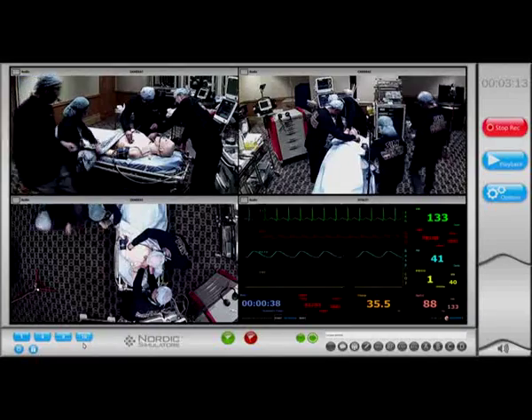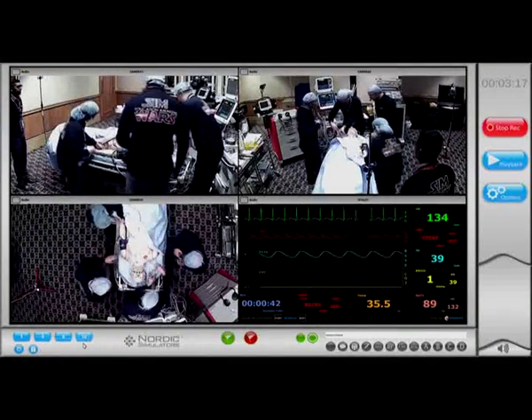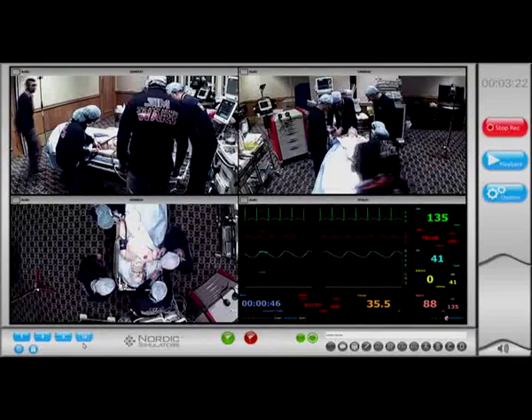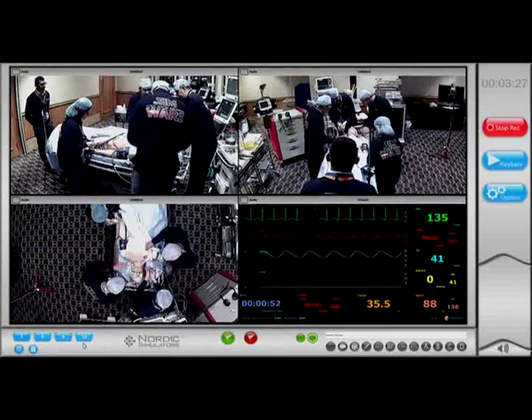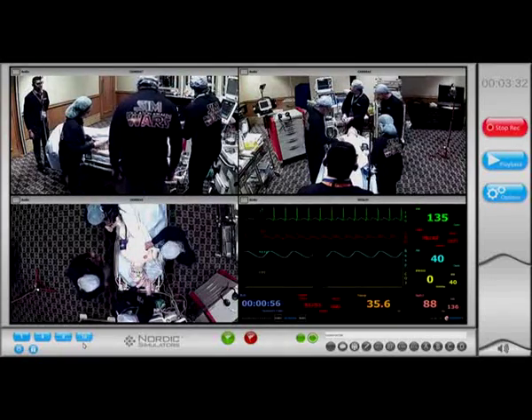Take a deep breath. Okay, I got a 22-year-old person involved in a road traffic accident. He's conscious, but he sounds disoriented. I'm just doing a respiratory examination. We're checking the vitals. Do you check the BP right now? Measuring. We have a saturation of 70%.